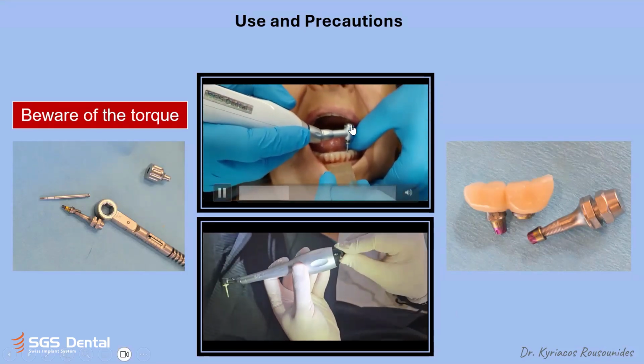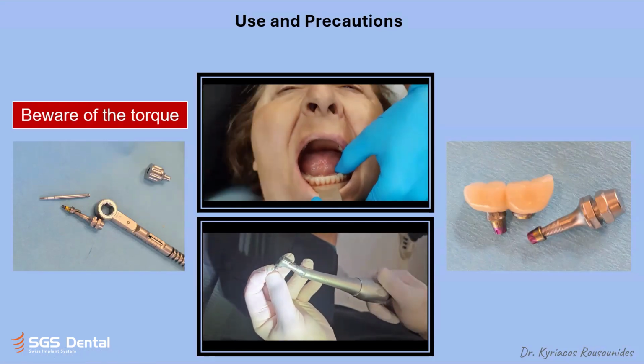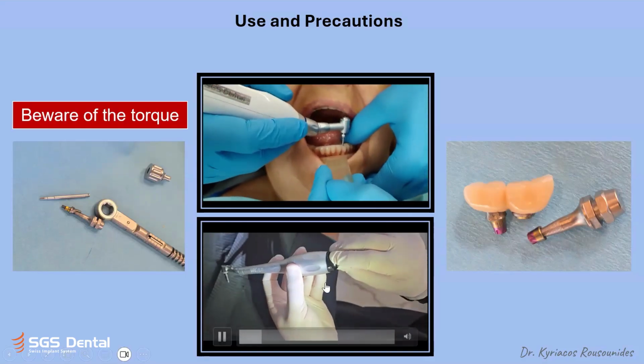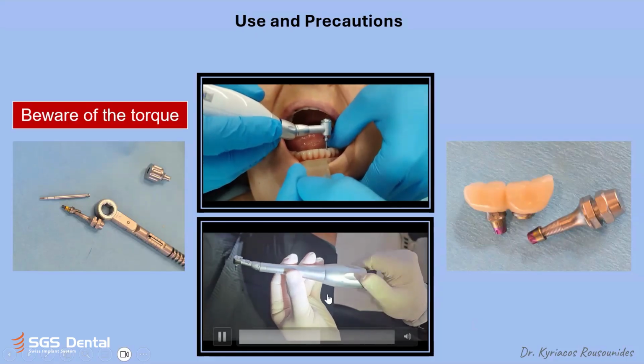Upper areas or lower back areas that we cannot easily reach with this instrument. It can easily be controlled and adjusted.